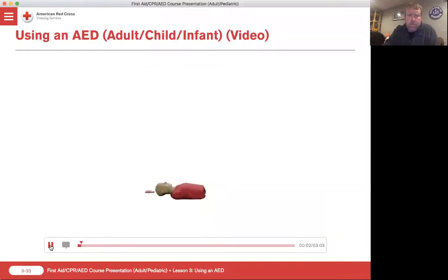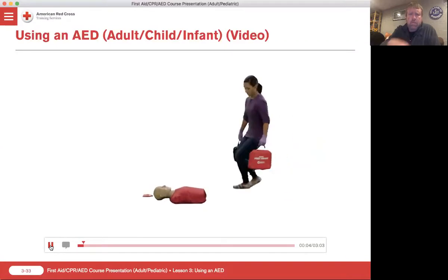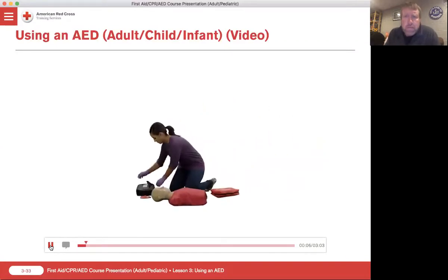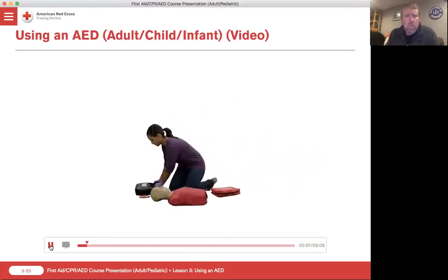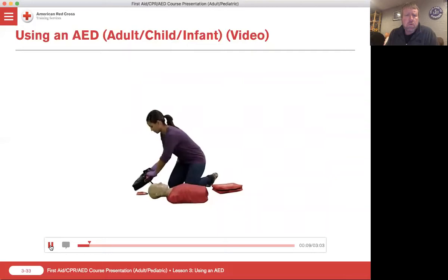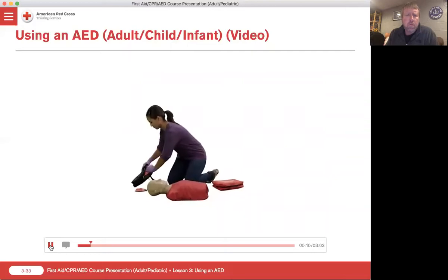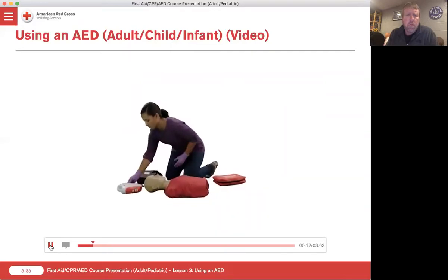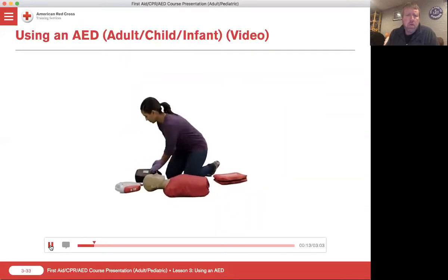When a person is in cardiac arrest, use of an AED can help restore a normal heartbeat. If you are the only trained responder on the scene, turn on the AED as soon as it is available.